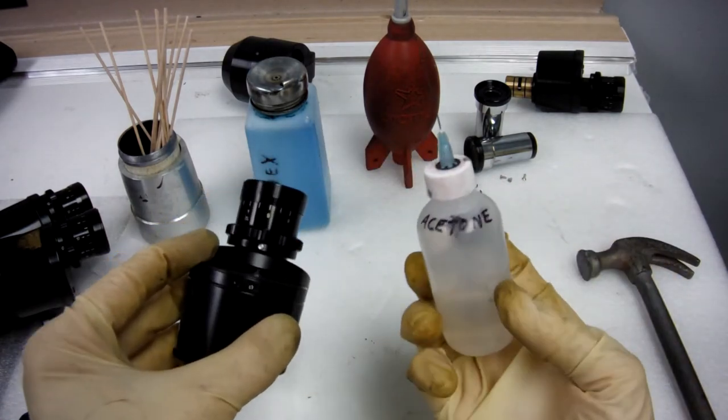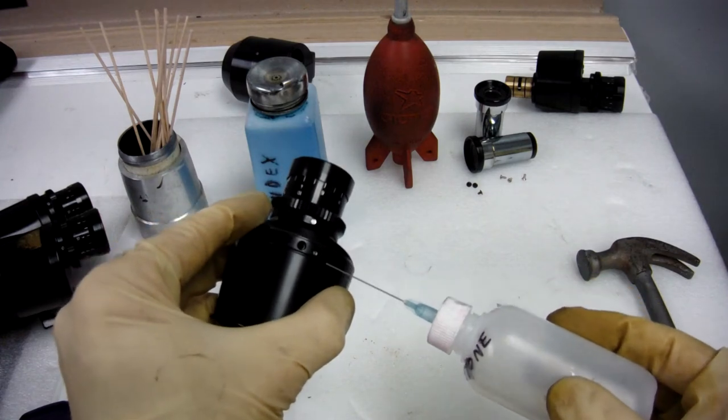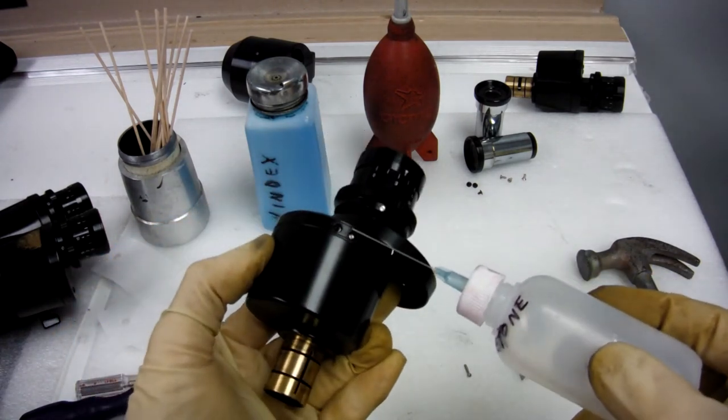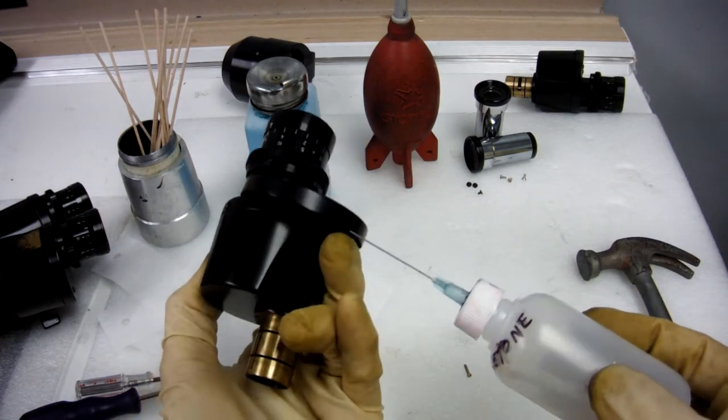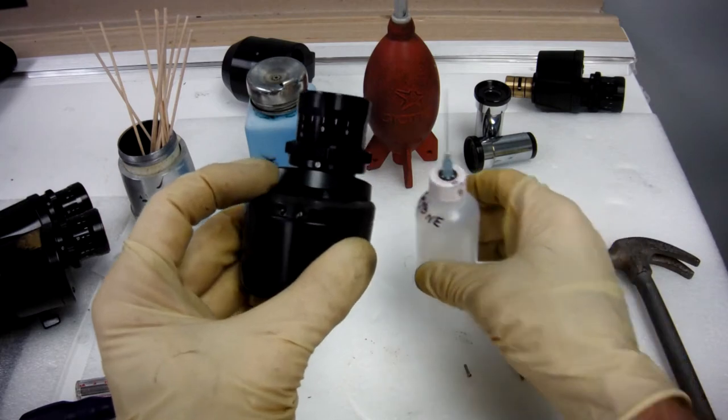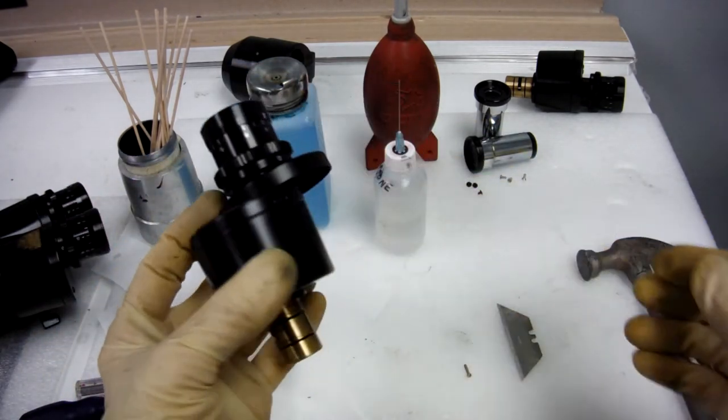You can try putting a little acetone in all the places where there's a lock screw. You can try to loosen the Loctite. Still doesn't work.